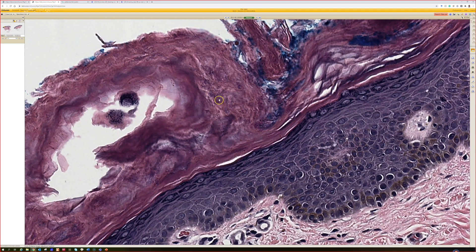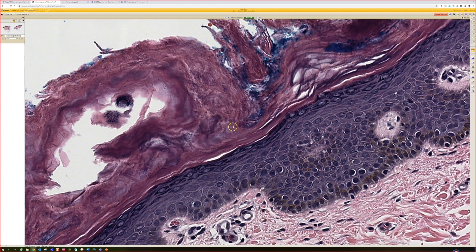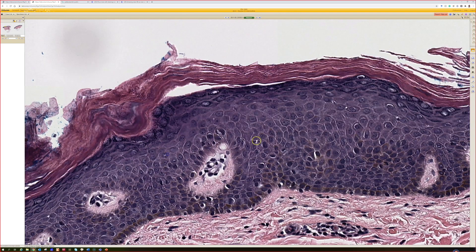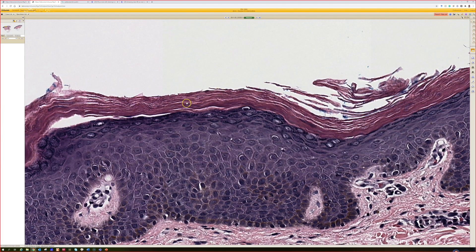I know that they must be here because this slide is labeled erythrasma and I do see little blue stuff. Even on the best of situations on a nice microscope with a good preparation, erythrasma organisms — Corynebacterium minutissimum — are tiny, tiny, tiny little thread-like blue organisms. The key to me is especially: I've never seen erythrasma outside of a fold site like groin or axilla. So when I see groin or axilla with compact ortho, I always look for erythrasma.